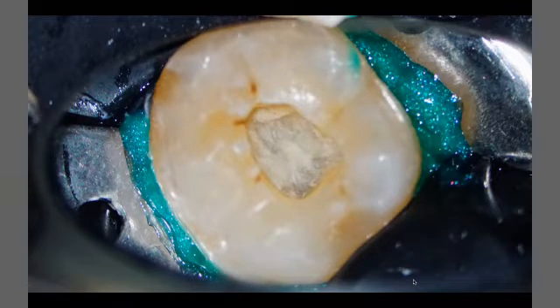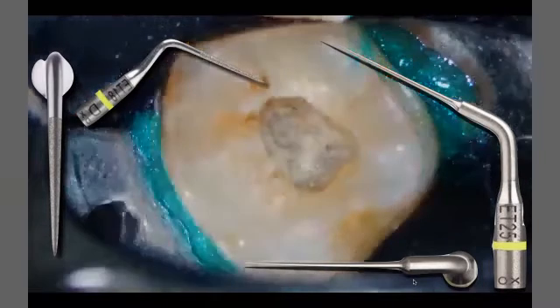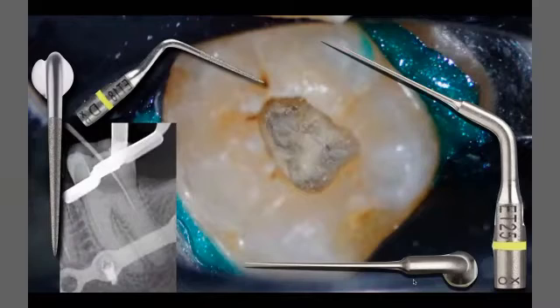As you can see here, I have calcified tissues. The bright dentine is the calcification. I have to remove all the calcification with ultrasonic tips. With diamond tips, I will start to remove the calcification. Then I will shift to the stainless steel, non-coated ultrasonic tips, just to break up the calcification more. Now you can see in this X-ray that I can see more colors. I can see dark dentine. I can see some points on the mesial side and also on the distal side.